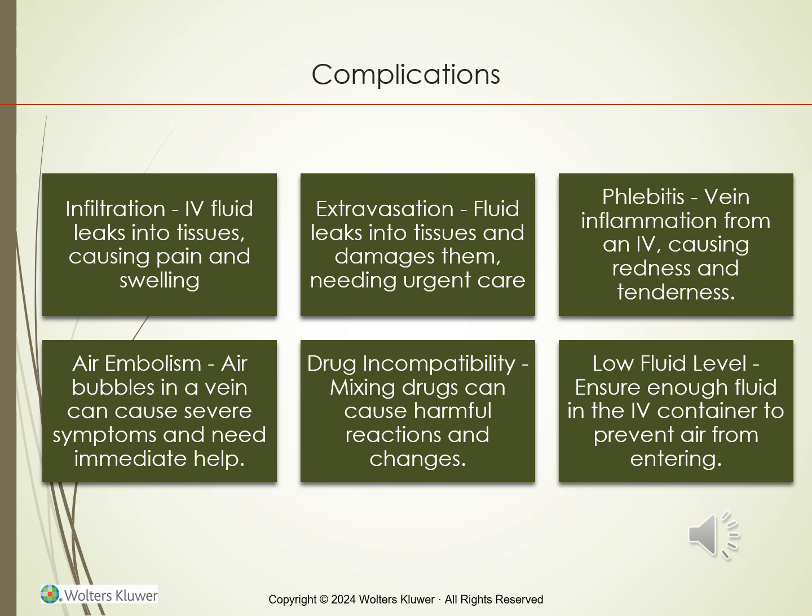Extravasation is the leaking of fluid into the surrounding tissue, causing tissue damage. It is a medical emergency, especially in pediatric and elderly patients. The symptoms include pain, burning, redness, swelling, and resistance to infusion flow. Immediate actions include stopping the infusion, aspirating remaining fluid from the area, and removing the needle and applying a cold or a warm pack while elevating the area of interest.